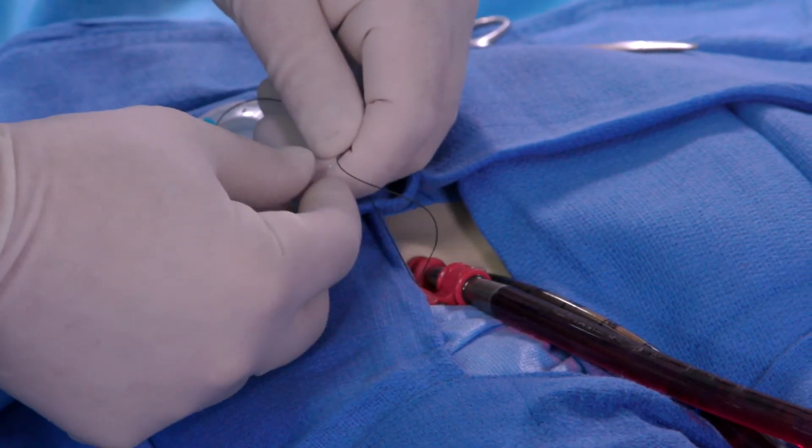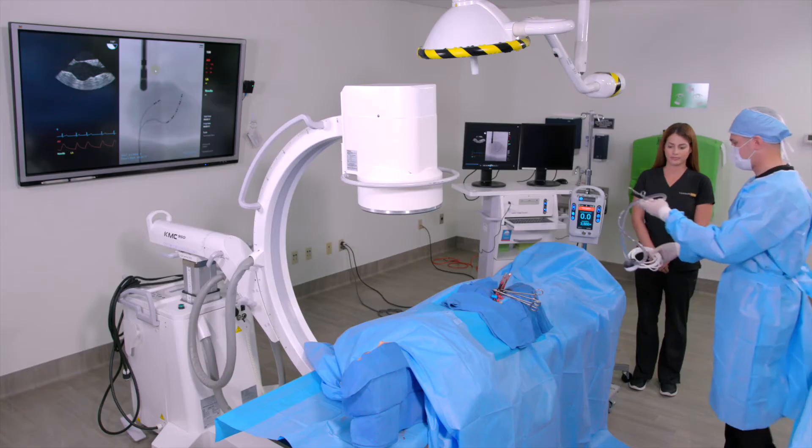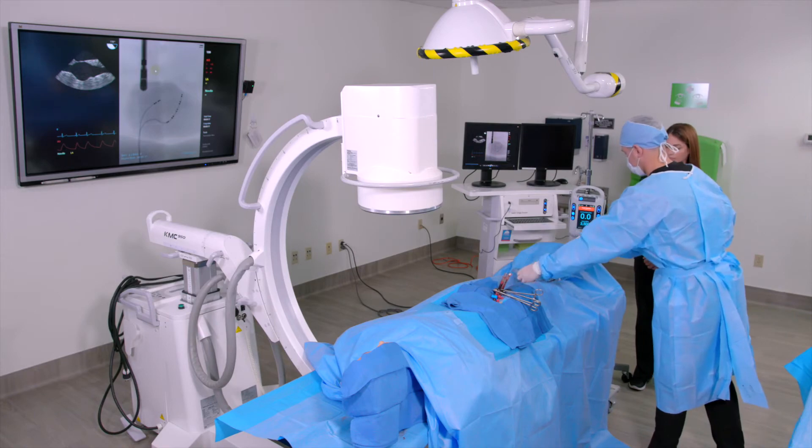Secure both cannulae to the patient's leg by suturing the suture wings provided with each cannula. Pump connection to the cannulae can now be performed.